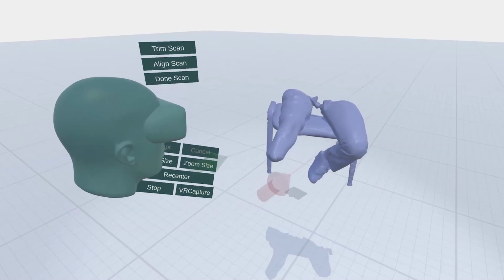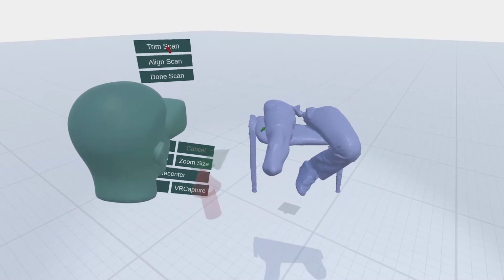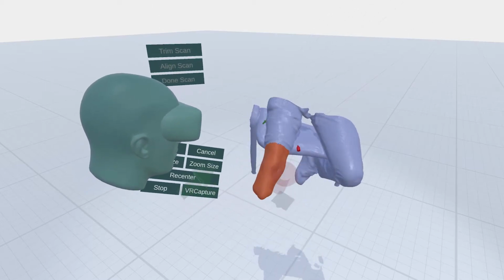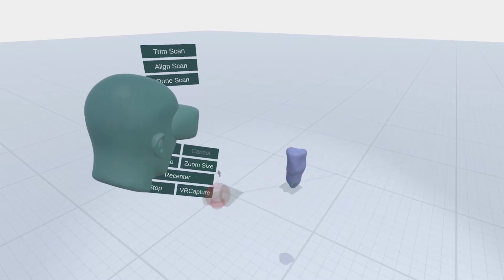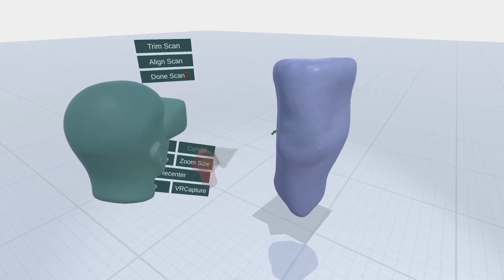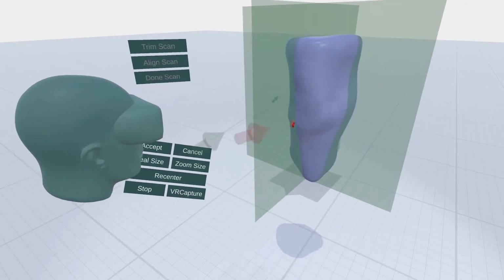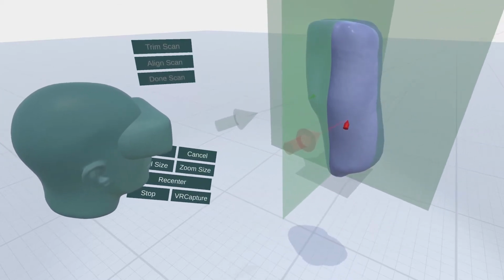The prosthetic design process in OrthoVR begins with a raw 3D scan mesh. The software doesn't know which part of this scan is leg, pants, or chair, so the first step is to highlight the region that contains the residual limb. The rest of the scan is discarded. In VR, we can easily make the limb much larger, about 1 meter tall, which makes it much easier to work on. The next step is to align the scan relative to the ground plane.